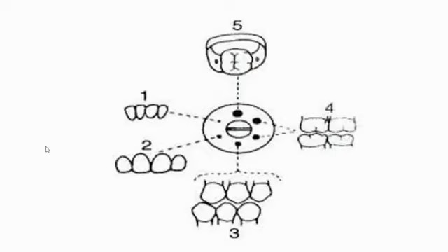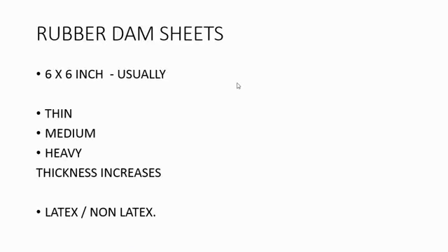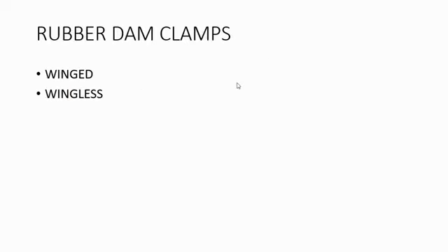So I think this component is clear. So this is a photo representing all the teeth. You can see the lower incisors. You can see the upper incisors, premolars and canine, and the molars or larger premolars and the larger molars. ठीक है, तो बहुत सिंपल है. तो रबर डैम एक कंपोनेंट आपको पता चल गया. शीट्स, तो कौन सा शीट लेना है ये भी पता चल गया. अच्छी क्वालिटी का निकटोन हो या फिर अदर कंपनीज आल्सो आई टेल. और टेम्पलेट को कैसे यूज करना है, सिंपल एक मार्क करके, और पंच को कैसे यूज करना है, वेरी सिंपल.